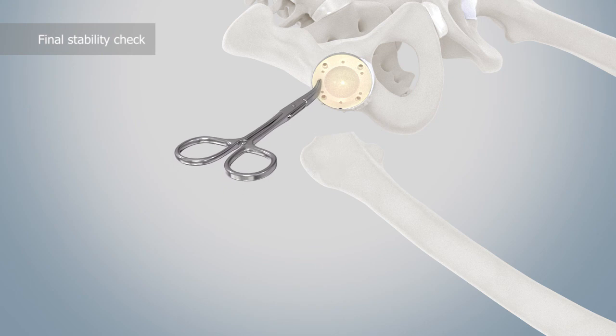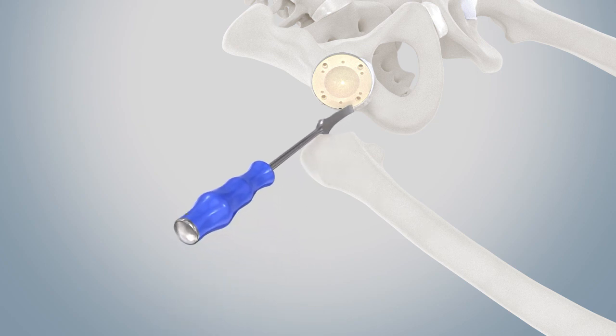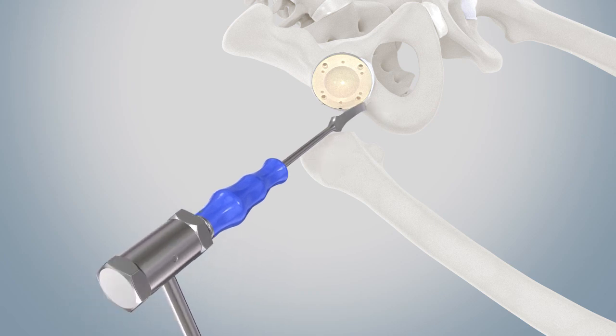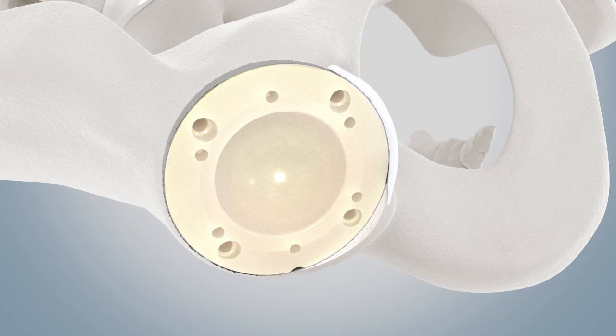Secure and correct cup fit is checked with a blunt instrument, e.g. a clamp on the outer acetabular rim. Care must be taken not to damage the polyethylene of the articulation. The osteophytes protruding from the acetabular rim can be carefully removed using a chisel. After completion of the cup implantation, the stem preparation now follows.